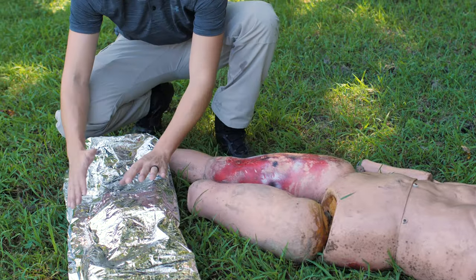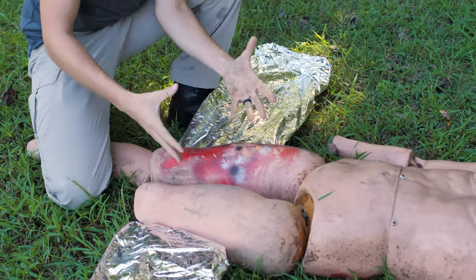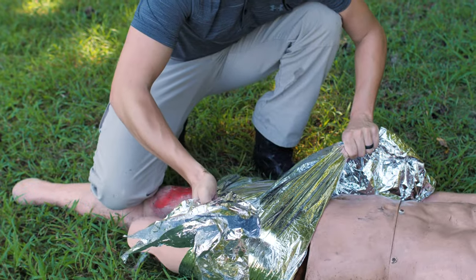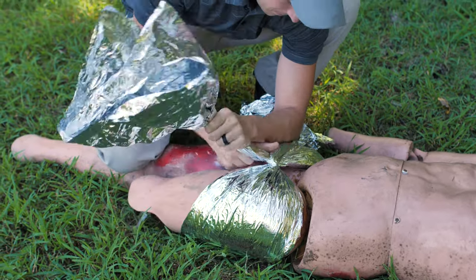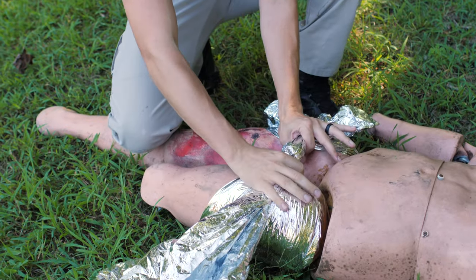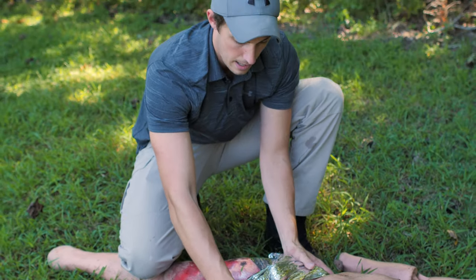I've taken the emergency blanket and folded it down to about a foot in width. Slide it under a void — we would slide under the legs and work it up. Once in place, pull it snug, then twist it several times to keep that pressure. Use a zip tie on either side, or duct tape, or tie it off somehow so it stays secured. This will help keep firm pressure on the greater trochanters to hold the pelvis together.